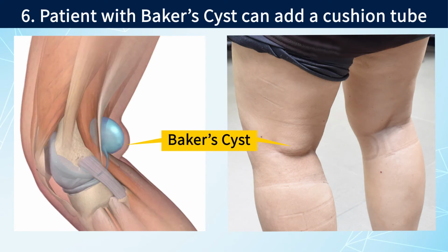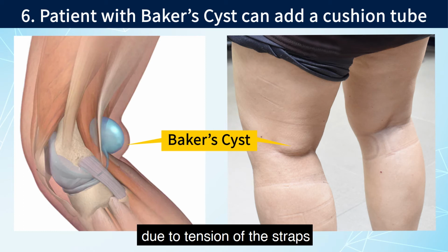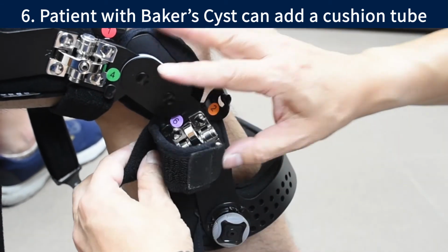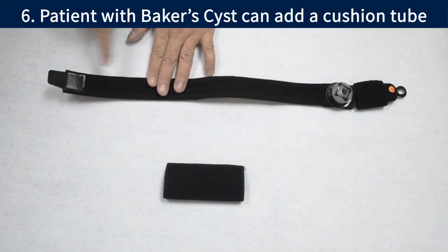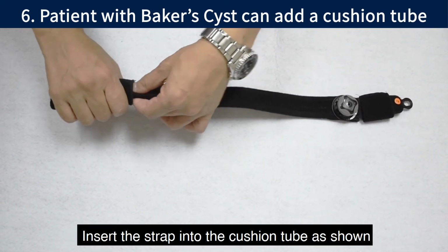6. Patient with Baker's cyst can add a cushion tube. If the patient has a Baker's cyst, there may be pressure sore on the cyst due to tension of the straps. The therapist can then add a cushion tube to the strap. First, remove strap 2. Fasten the Velcro part. Insert the strap into the cushion tube as shown.